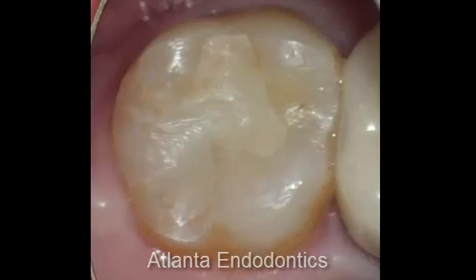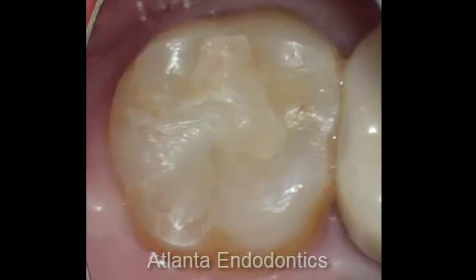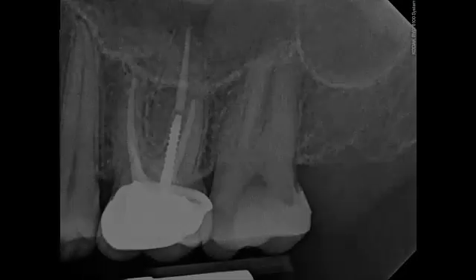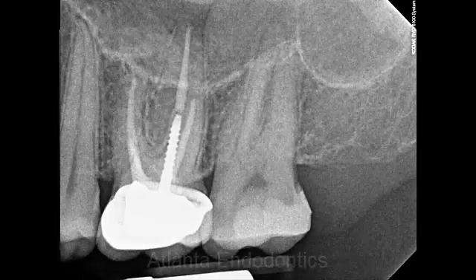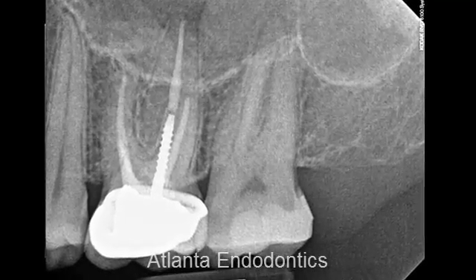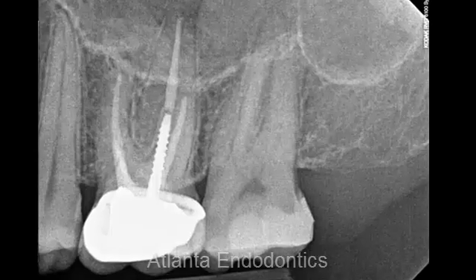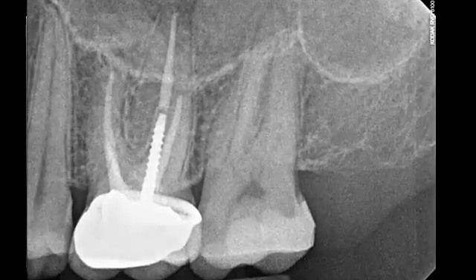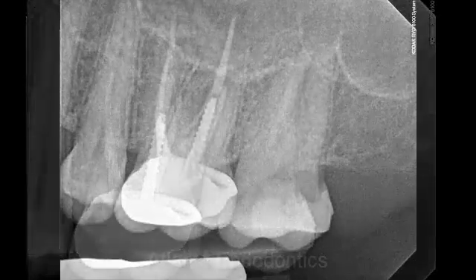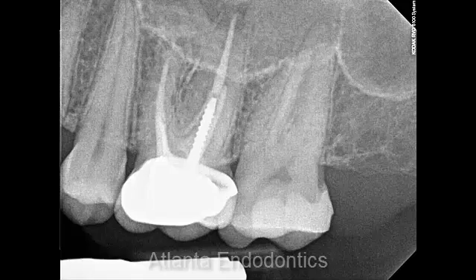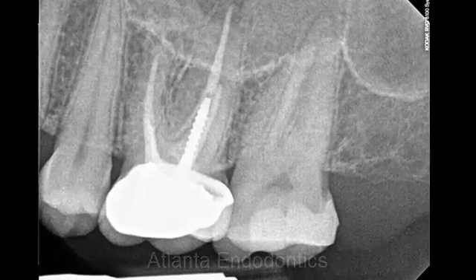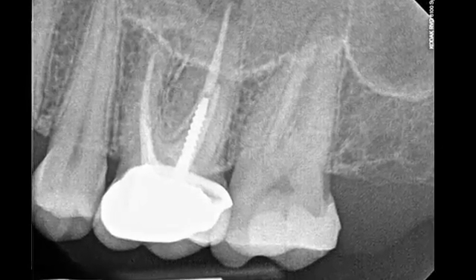This lady had an irreversible pulpitis. The occlusion had been adjusted several times, and radiographically it appears to be for the most part a run-of-the-mill upper second molar. The off-angle x-ray doesn't show anything unusual or any great amount of concern.